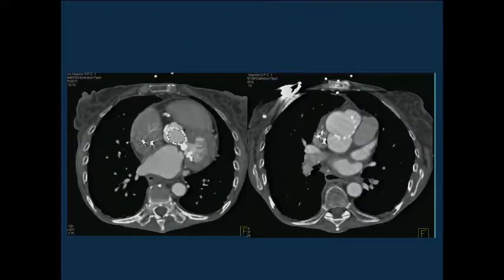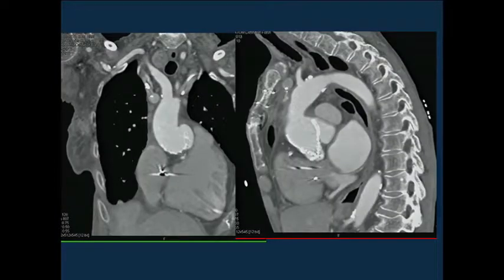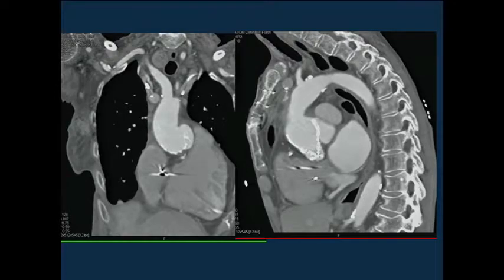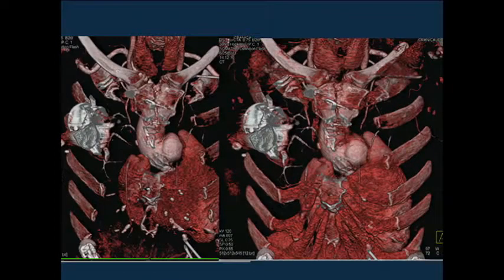Here is the arterial imaging, and I'll show you a couple reconstructions. There's an oblique view looking at the root and then a couple of 3D images looking at the area.